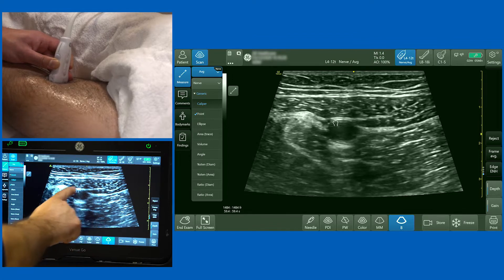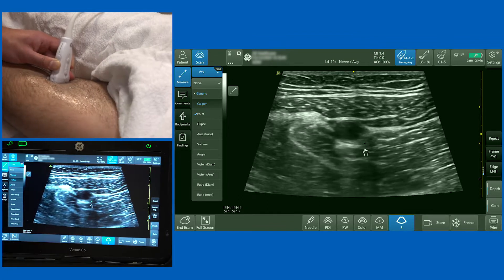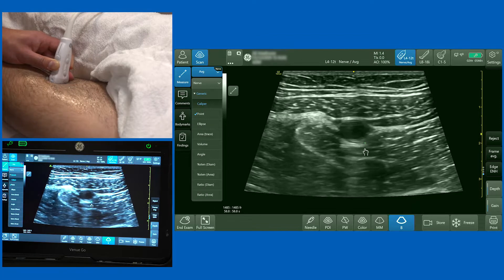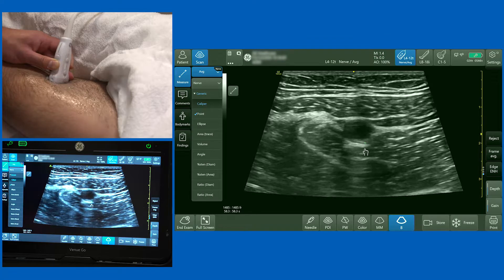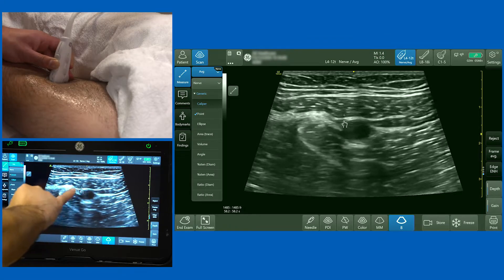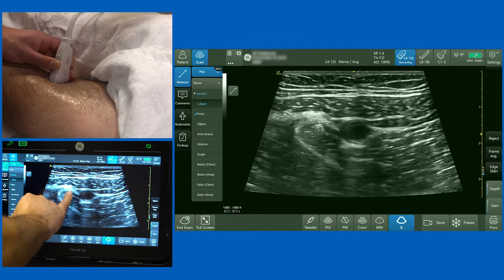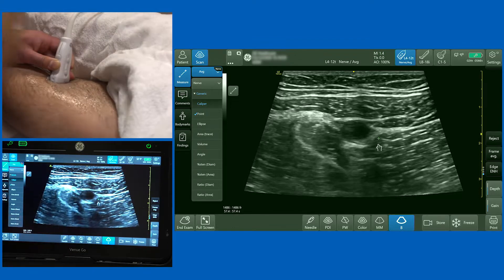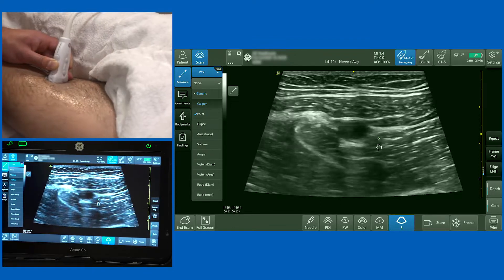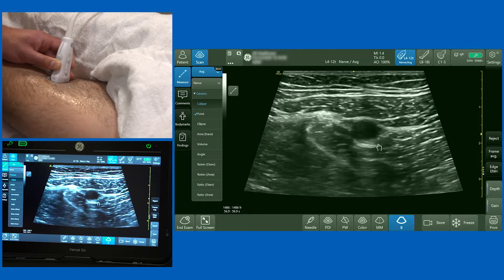There's a vasoadductor membrane that lies above that structure, and you know you're in the right place because when you inject local anaesthetic you see the artery collapse down. In some circumstances there's a subsartorial plexus that lies on the medial aspect of the artery in this subsartorial tunnel, so a circumferential spread of local anaesthetic around the artery is often warranted.